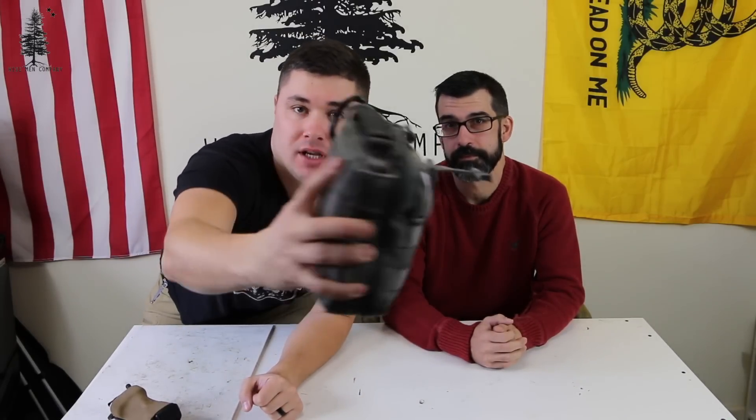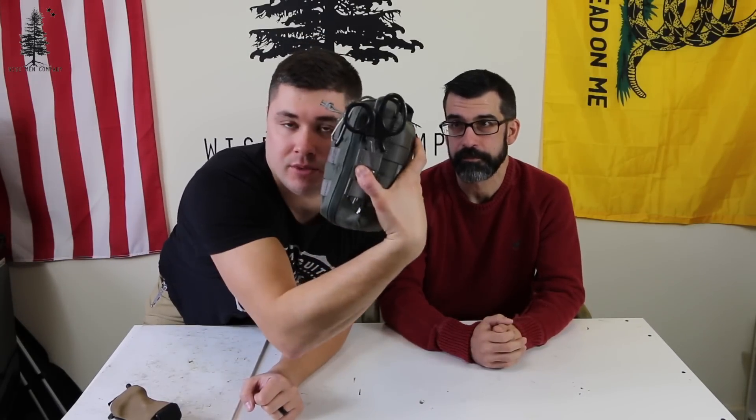We haven't rearranged anything on this medical pack. This is their bigger, more loaded-out medical kit — it's got a ton of stuff in it. It comes in this Maxpedition carrier, which is really cool. EMT shears on the side are included as well. We haven't moved anything in this kit. This is exactly how it comes, and we're going to dive into it with a closer look.